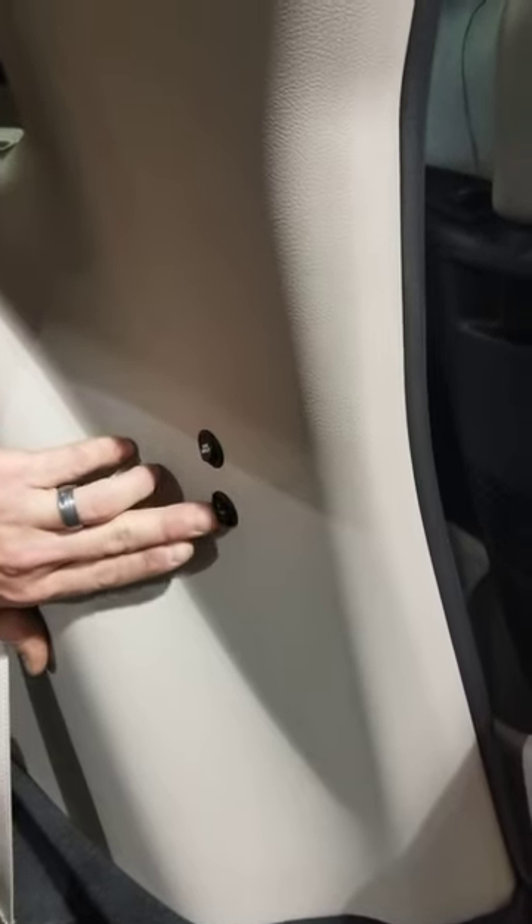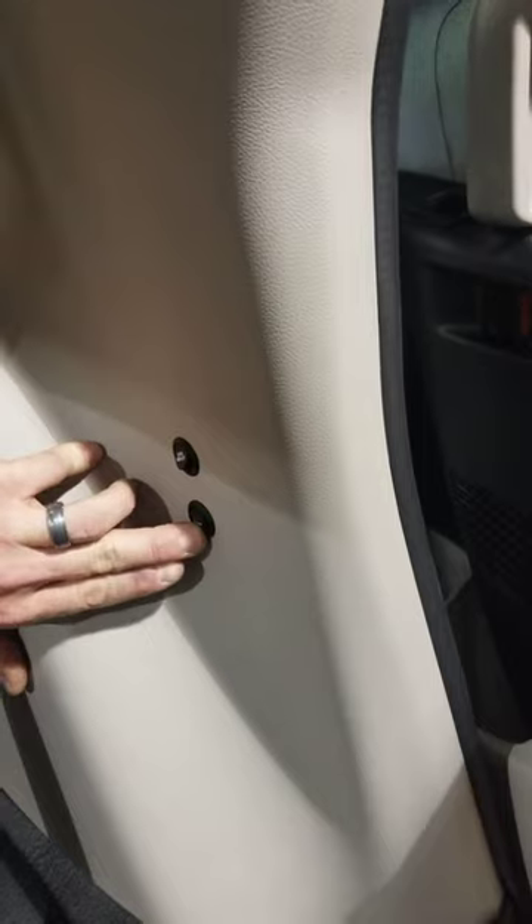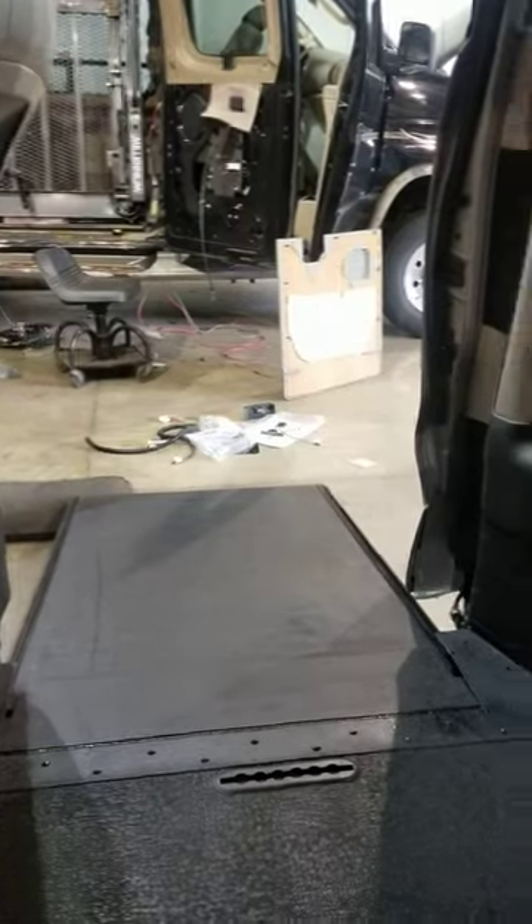Down here, this other switch has ramp in and out. If you look, I'll go out — the ramp is coming out when you press it. Then you toggle it up to bring the ramp in.